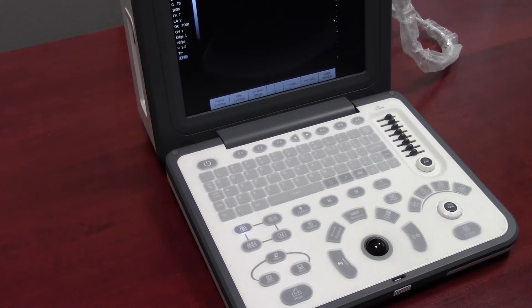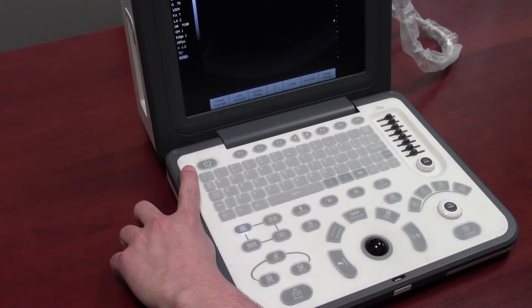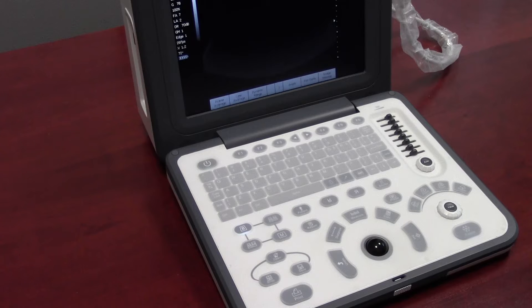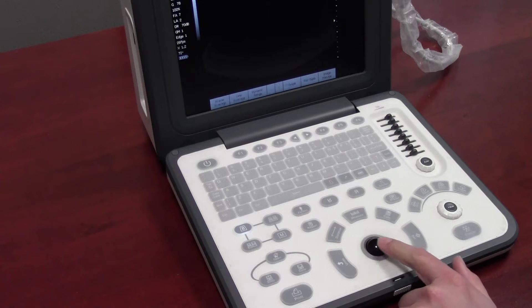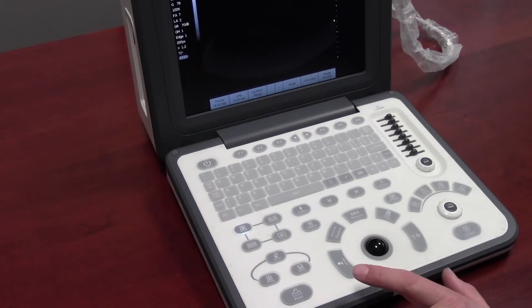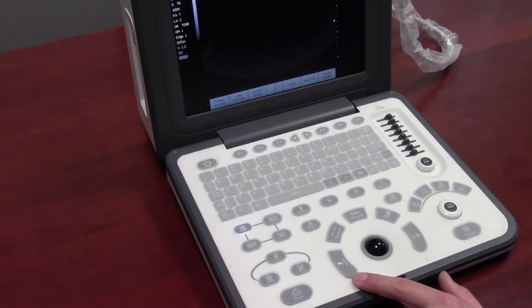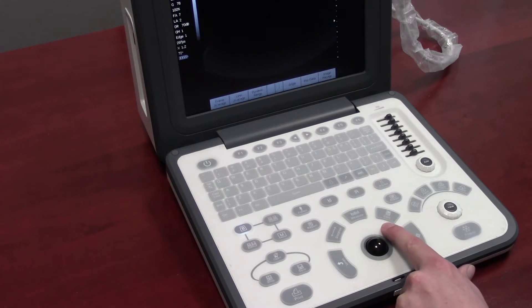This is the knobology video on the Emperor N5 VET version. The first thing you want to do is press the power button and wait for the machine to boot up to imaging mode. Use the trackball to scroll through menus, the set key to make selections, and the undo key to undo your selections. You can also use it to make measurements and calculations.